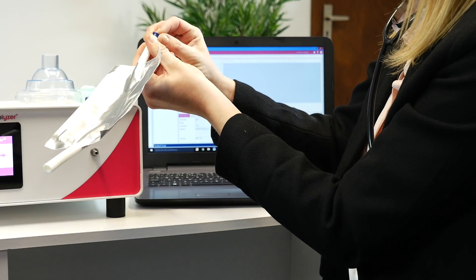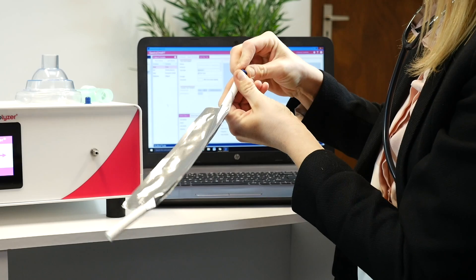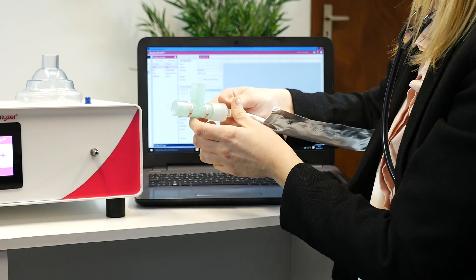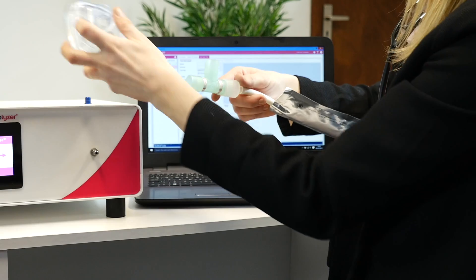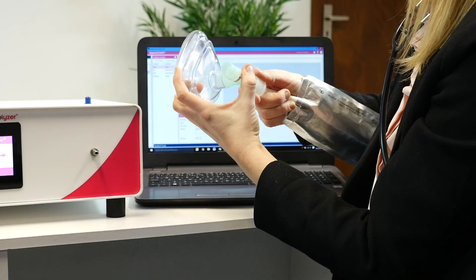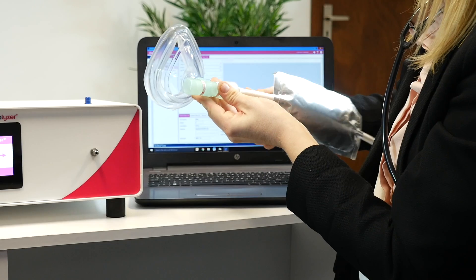For infants or patients who struggle to hold their breath, there is also the option for a face mask breath test. Insert a blue plug into one end of the breath bag and insert the other end into the face mask adapter, then attach the face mask. The patient should breathe normally into the face mask until the breath bag is filled.